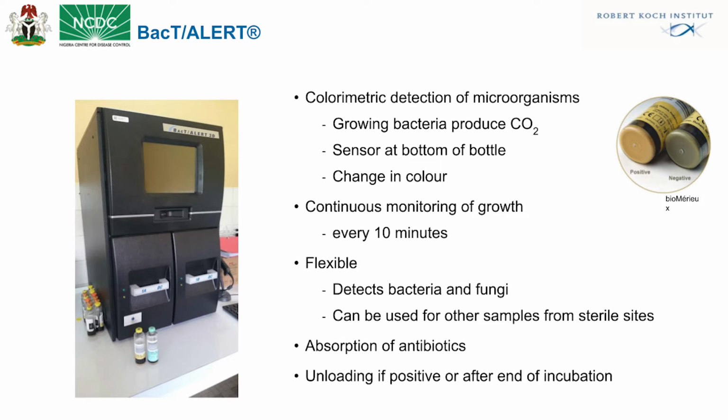The fourth advantage is adsorption of antibiotics, and this is made possible by the presence of resins in the bottles, in the BacT/Alert bottles, which absorb any antibiotics that the patient must have been on prior to sampling of the patient for blood culture analysis. So when this happens, the outcome of the analysis is not affected by the antibiotic therapy the patient has started.